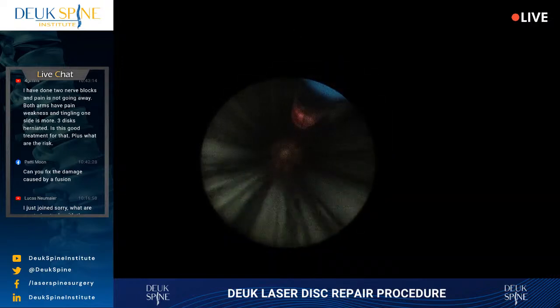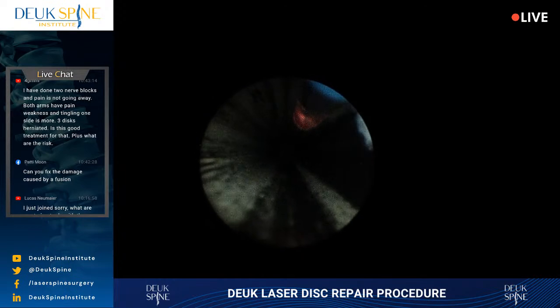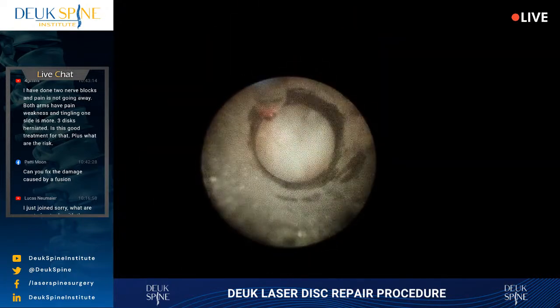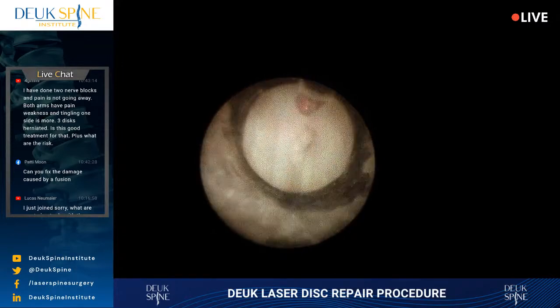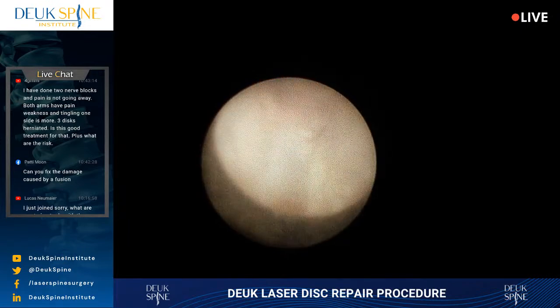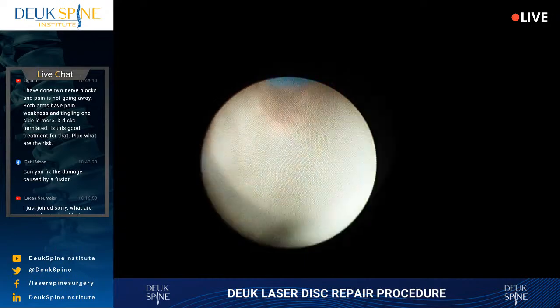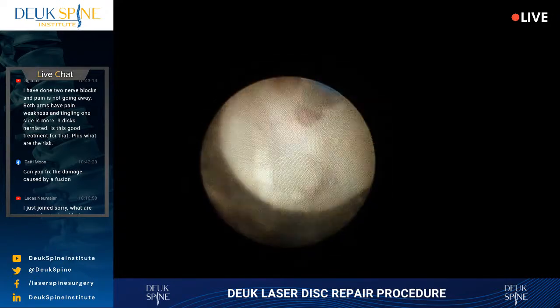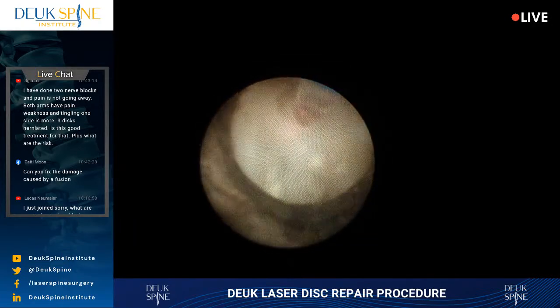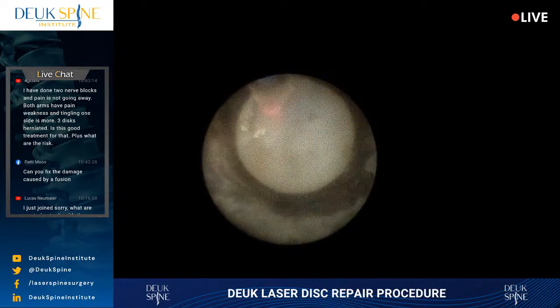You doing all right? Yes, sir. How's our irrigation? Did you order the... We ordered, yeah. Make sure the laser power doesn't touch my face or your face.